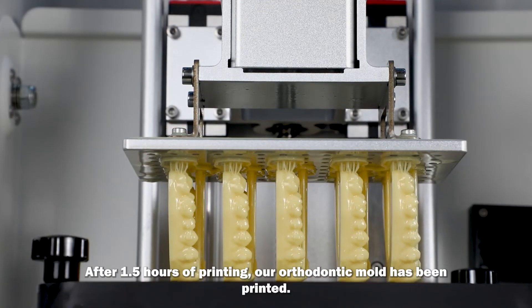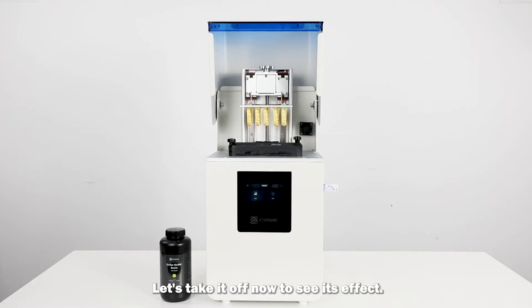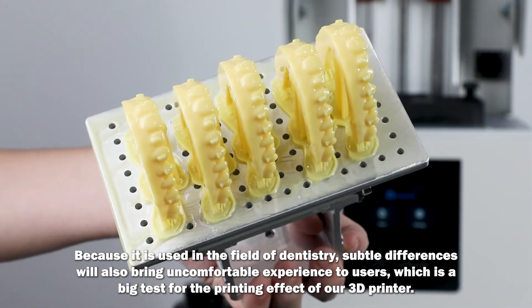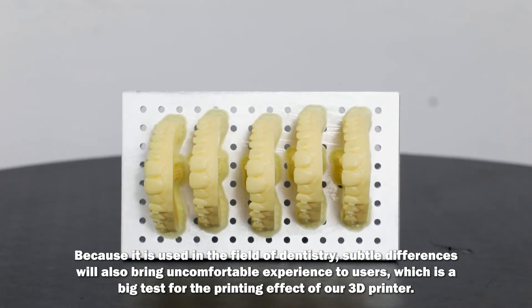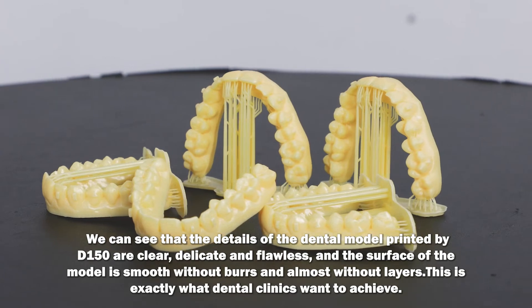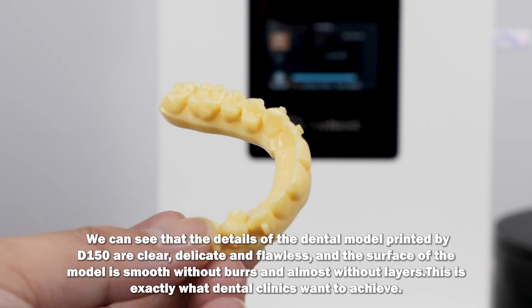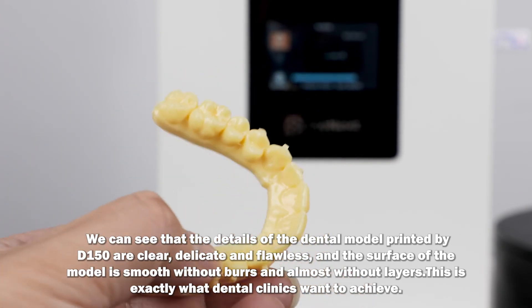After 1.5 hours of printing, our orthodontic mold has been printed. Let's take it off now to see its effect. Because it is used in the field of dentistry, subtle differences will also bring uncomfortable experience to users, which is a big test for the printing effect of our 3D printer. We can see that the details of the dental model printed by D150 are clear, delicate, and flawless, and the surface of the model is smooth without burrs and almost without layers — this is exactly what dental clinics want to achieve.